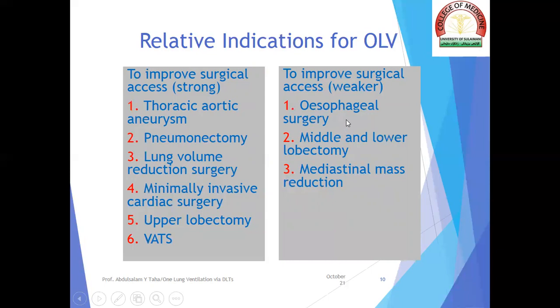While the weaker need for improving the surgical access is encountered in esophageal surgery, middle and lower lobectomy, and mediastinal mass reduction.